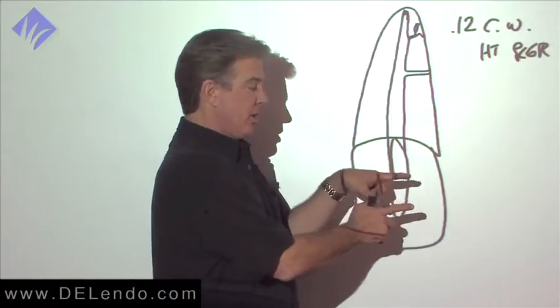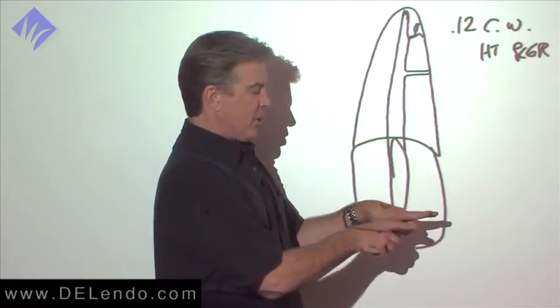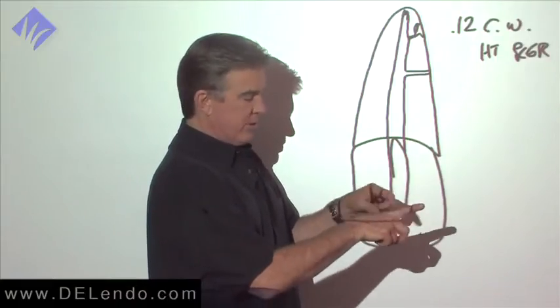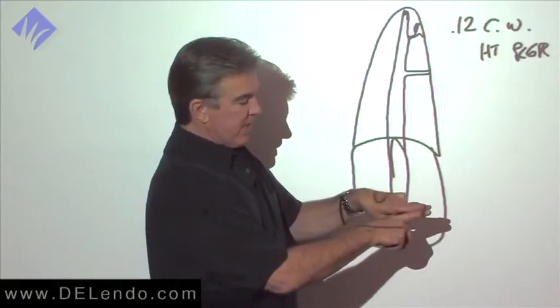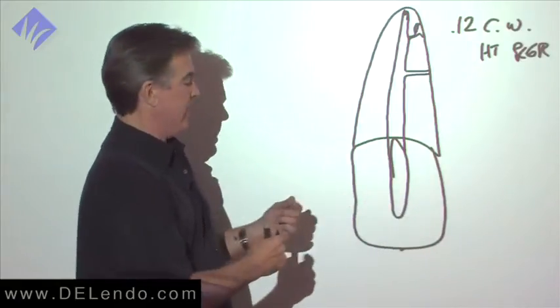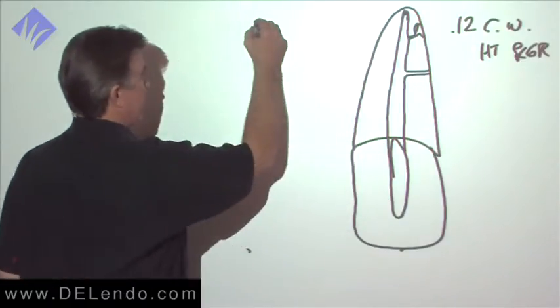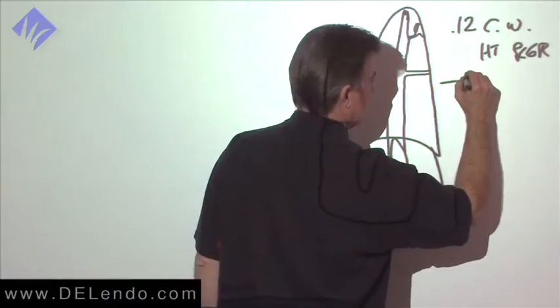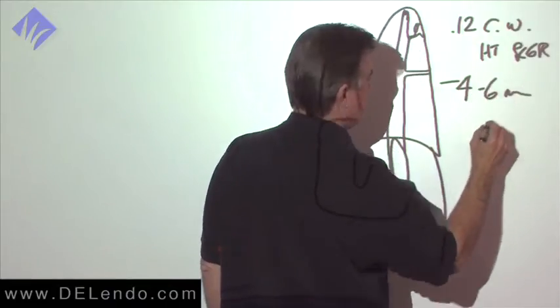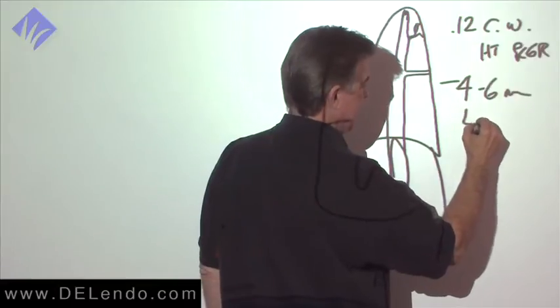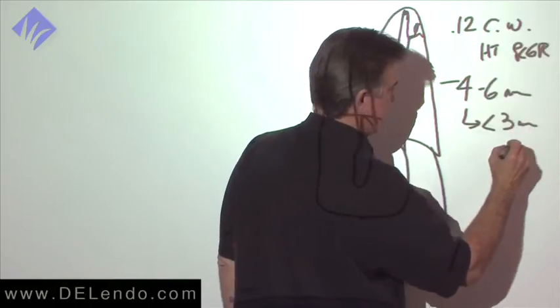We then compare that plugger to the cone we fit. The cone we fit has a pinch mark on it. We put the little stop on the plugger next to the pinch mark on the gutta percha, and we'll see how close the tip is to the end of the root canal. What we want is the plugger to fit within four to six millimeters is ideal, but if you get less than three millimeters, you have trouble.